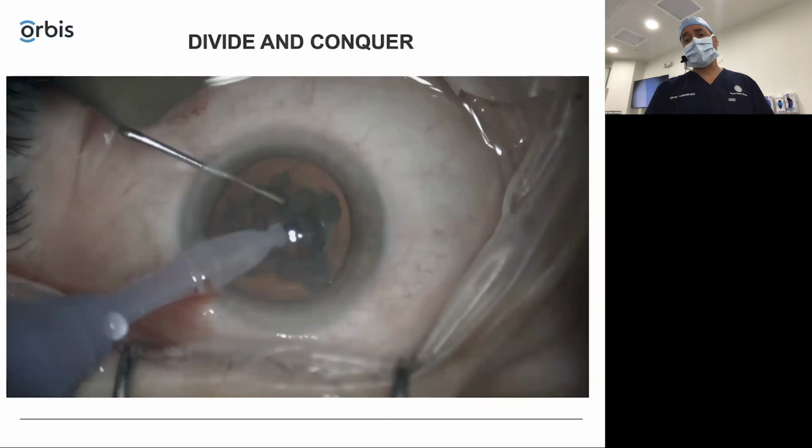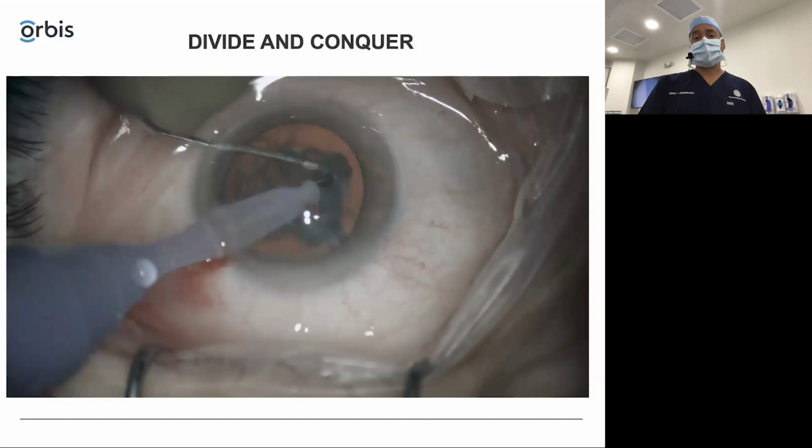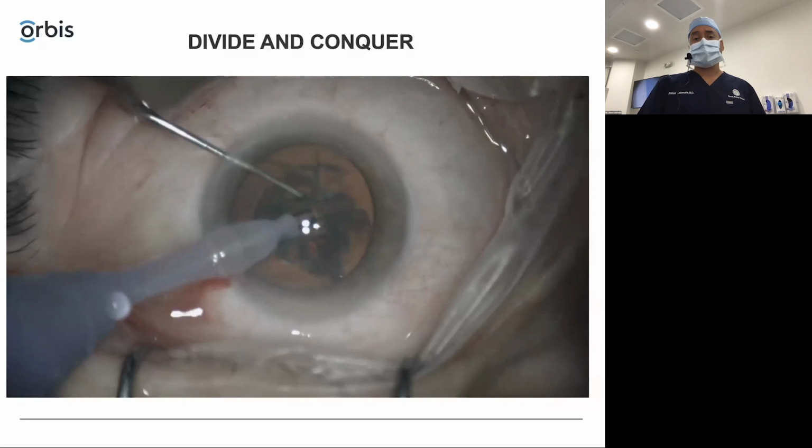If you put your instrument in and you can't crack it, it's because you're not deep enough, okay? And the first one always needs to be the deepest. The other ones kind of go easier. So I like to make all 4 quadrants.